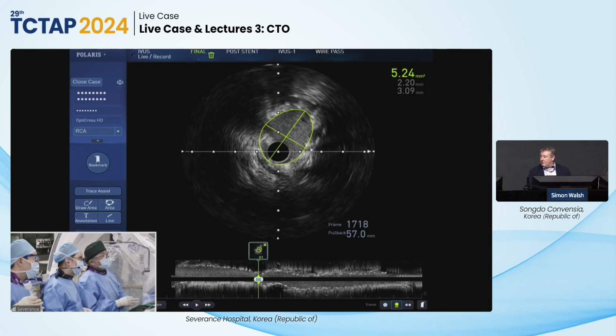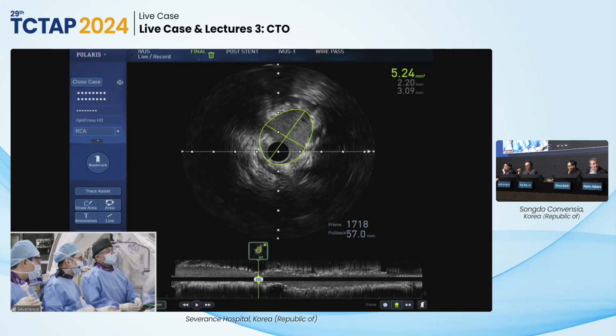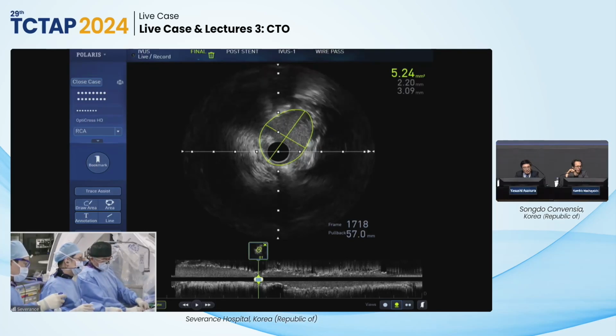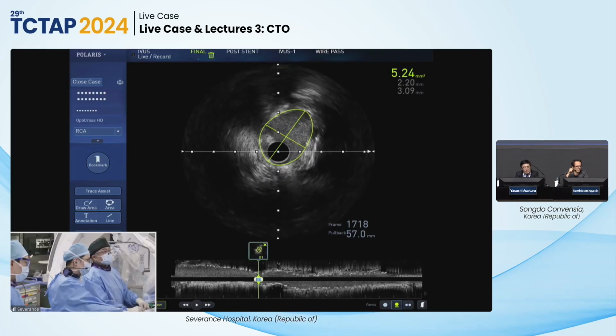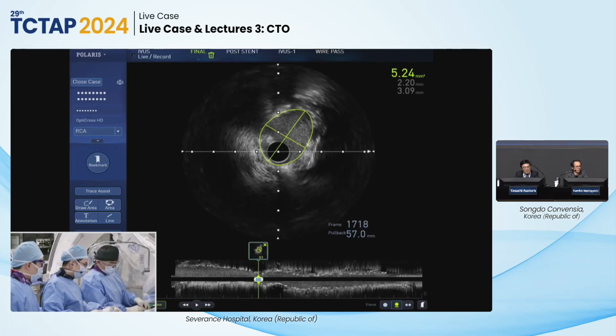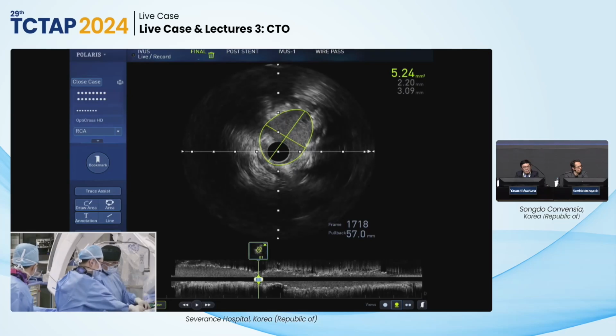So area maybe the 5.3 something. So in Japan, you gained a little bit more, 0.7. Habara, what do you think? I think it's definitely more. I think I remember it was 4.4, right? Visually, from the visibility as well. But I don't think you can achieve really much more there. Probably I would leave that, because if you go now with 3.5, might even rupture on the other side.